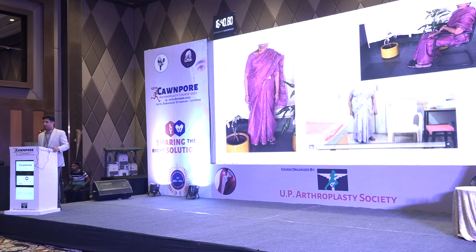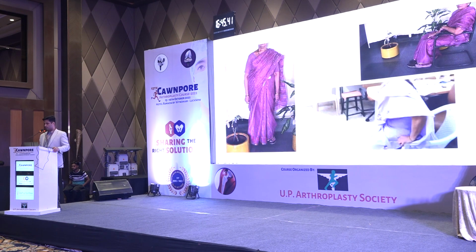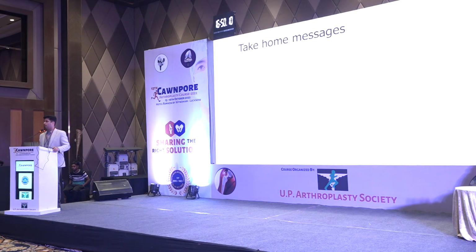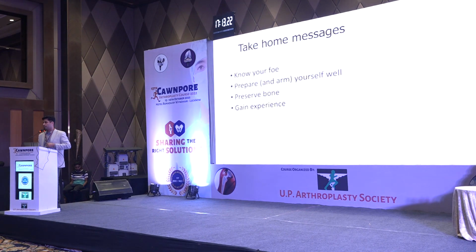But in short, what I wanted to highlight here is that there is no single way to do this surgery. You have to accommodate all possible problems. I showed you a slide in the beginning. That's your take-home slide. But understand which kind of problem you have in front of you. Know your foe first. Prepare yourself, arm yourself properly with all the possible necessary instrumentation. Preserve bone as much as possible, because bone is your friend. And of course, gain experience.